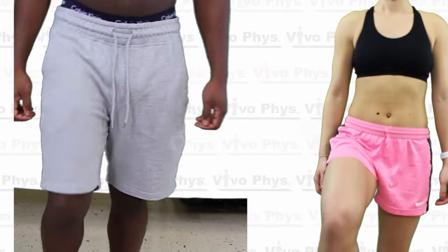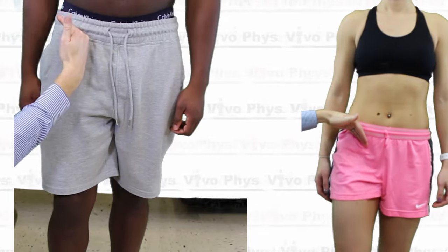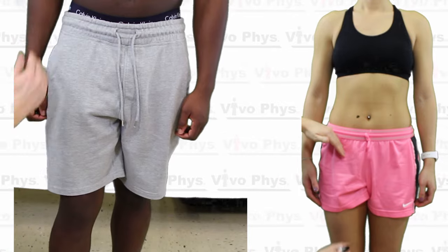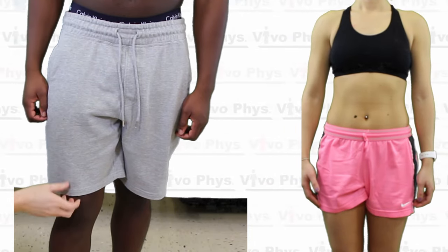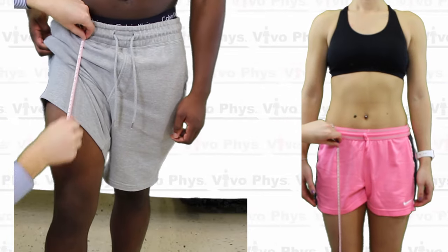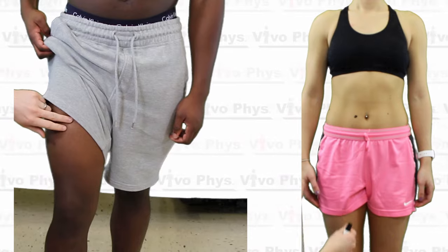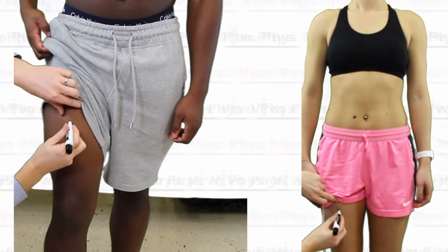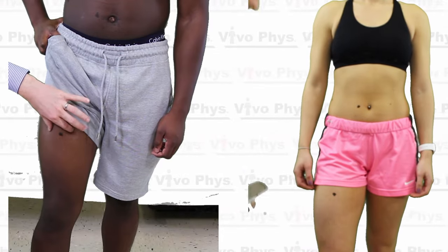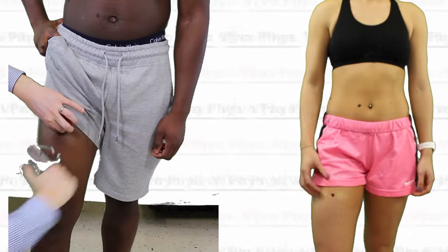The thigh skin fold is oftentimes the most difficult — the fat, muscle, and skin just sort of intertwine sometimes, but just do your best to separate them as much as you can and do the pinch. The thigh skin fold site is going to be halfway between the inguinal crease on the right leg and the patella on the right leg. The inguinal crease is that crease your leg makes when you lift your knee up — the crease between your torso and your upper thigh. So again, halfway between those two on the midline of the front of the right leg, and you're going to be doing a vertical skin fold here.